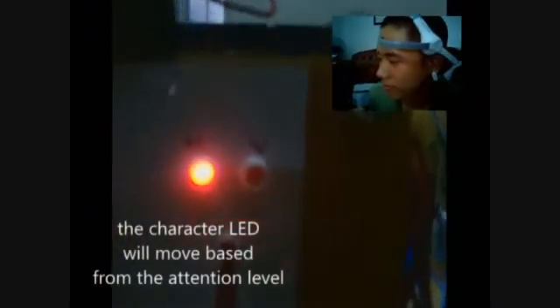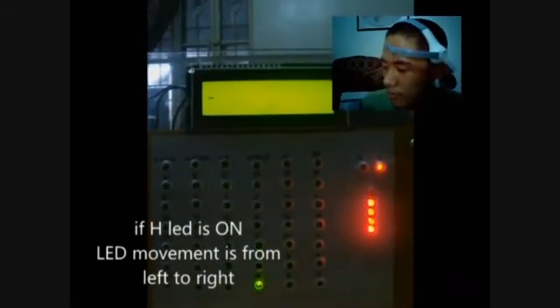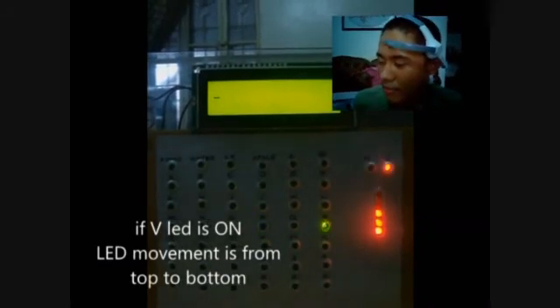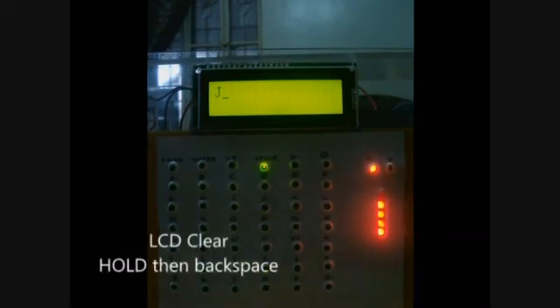Using the device: to move the LED light selection, attention level must be greater than the attention setting. To increase attention, you must focus. The LED light will start to move from left to right if the horizontal red LED is on, and from top to bottom if the vertical red LED is on. You can switch between H and V by blinking once. Blinking two times will select the character and copy it to the LCD. There are shortcuts to clear the LCD screen — select 'hold' followed by a backspace.